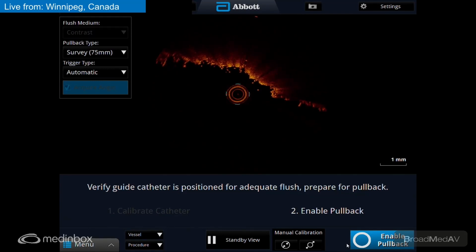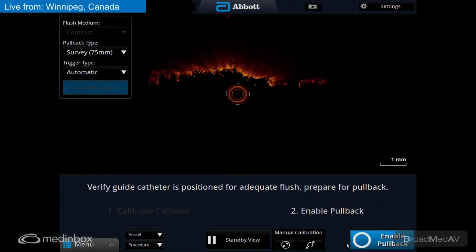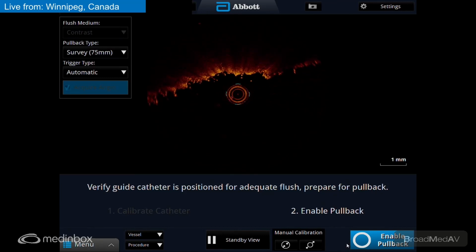I'm thinking I'm getting close to getting another wire down. I think because it's stent-stent interaction, maybe the guideliner is not the best. Can we get an extra support wire on deck just in case this technique doesn't work? There are lots of options there. Like you said, an extra support, Balance Heavyweight, the Wiggle Wire is everyone's favorite. Yeah. That'll be a nice bounce off.